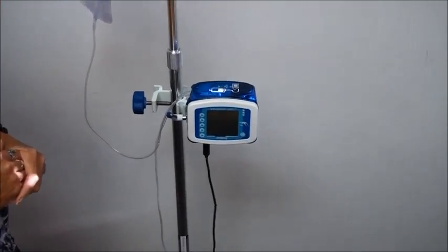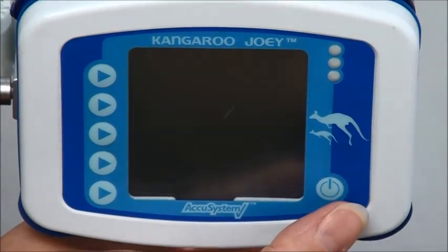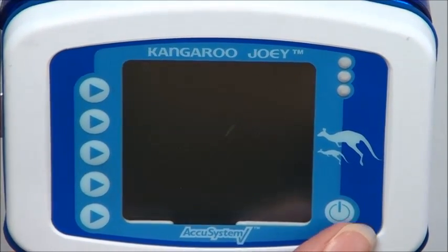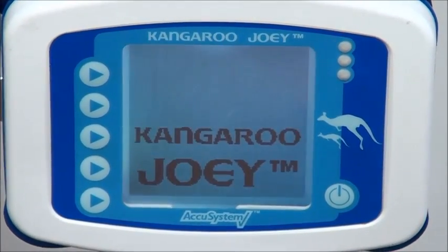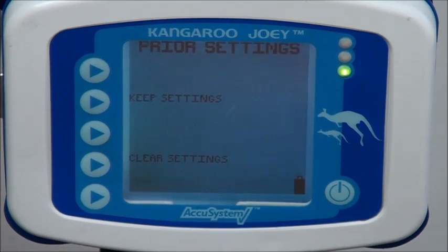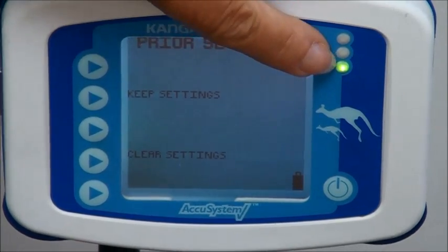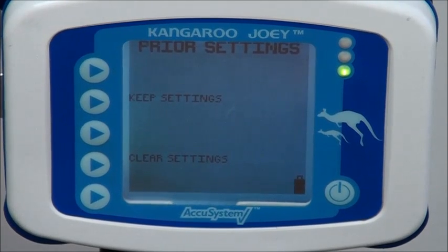Alright, so we're ready to turn on and program the pump. Down in the right-hand corner of the pump is your power button. So you're going to just reach over there and push that button and your pump is going to power on. It's going to go through a quick self-check and you're going to see the green light come on. And then the screen is going to show you a few things.